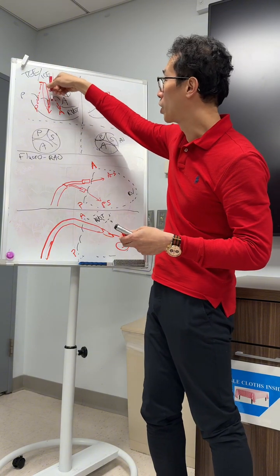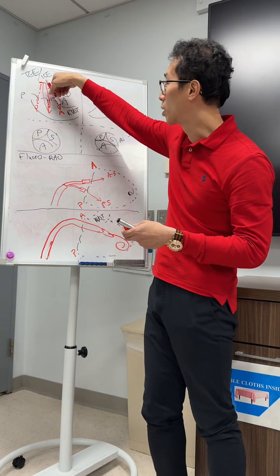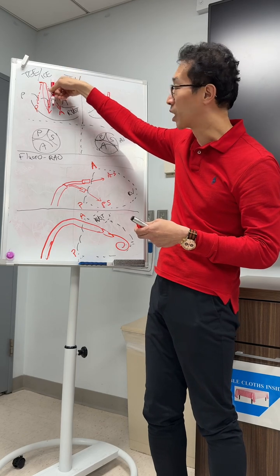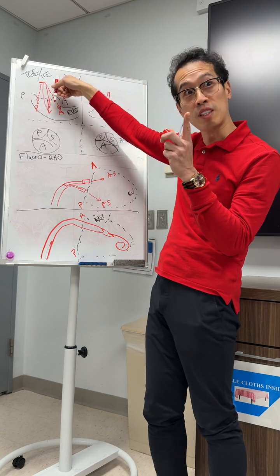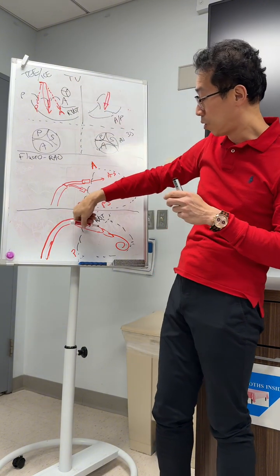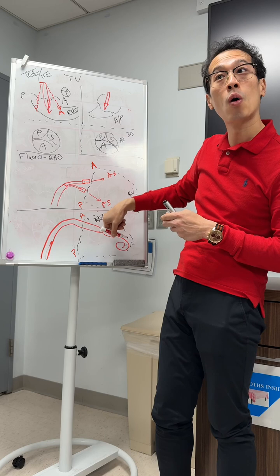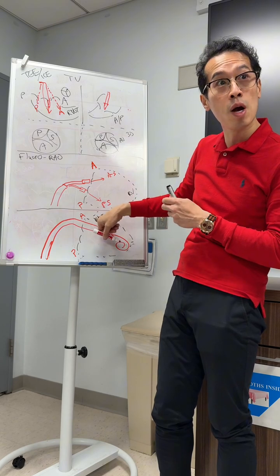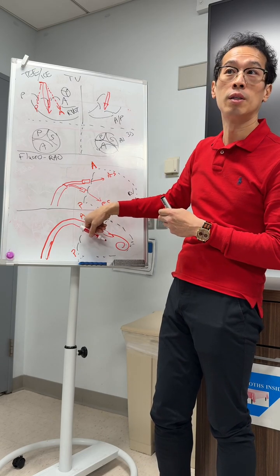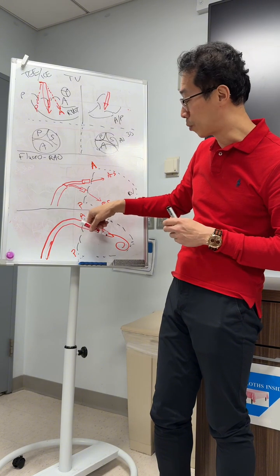Now, with Evoque, you have to see also where you are. So if you are going to this dive, you can flex some more. But remember, you have a stiff wire. So if you flex, look at this here. If you flex, it goes this way. But then your stiff wire might be holding you back. You might have to pull back the stiff wire a little bit to allow it to drop down. Okay, you understand what the principle is?